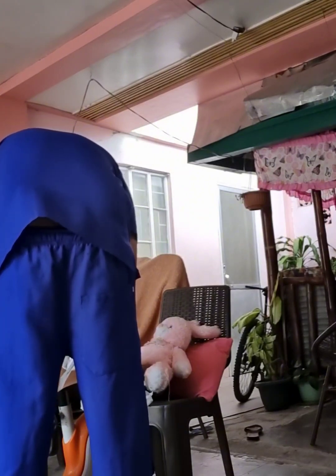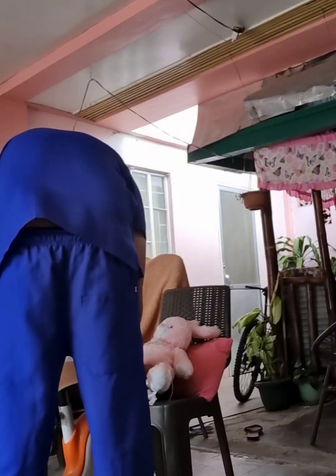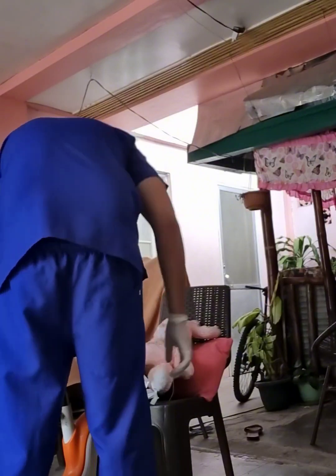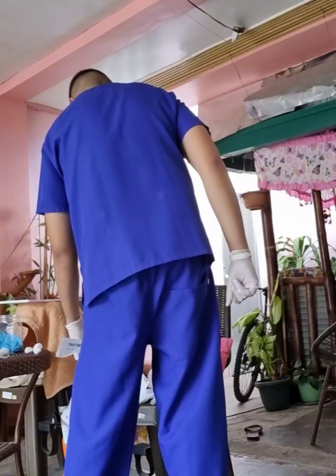Use the sterile hand. And then the dominant hand is the only one that handles the catheter. Hold.